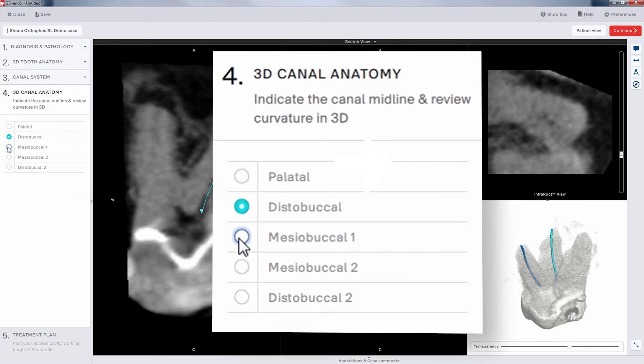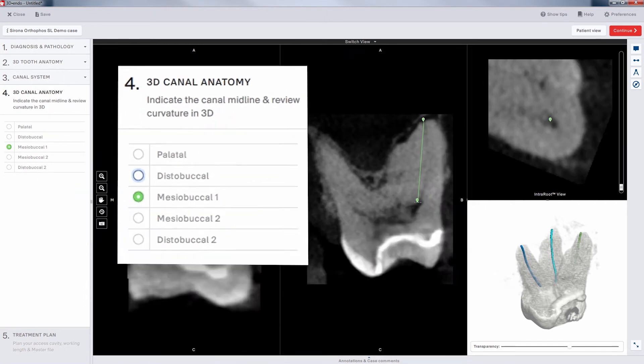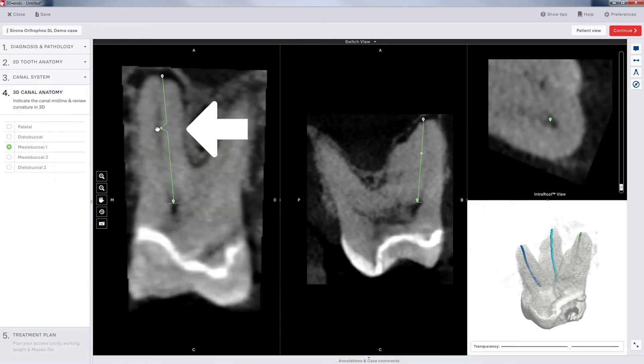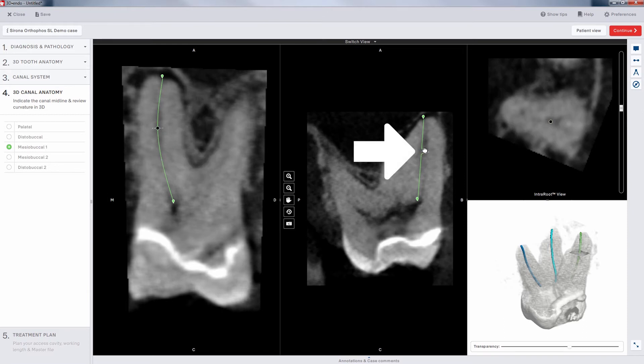Here's the MB1. A few clicks in the left-side window, dragging the points appropriately, helps the 3D Endo software mark the canal space. Go back and forth between the windows to get the optimal alignment.